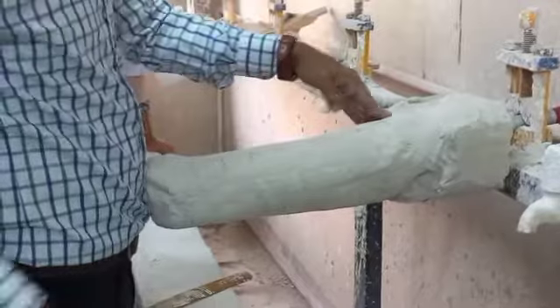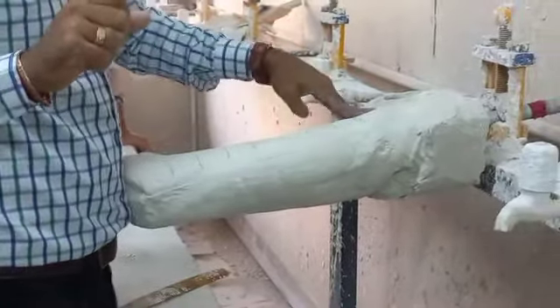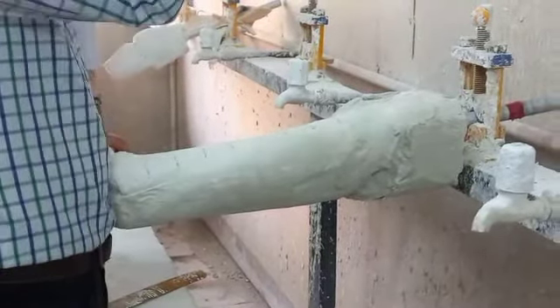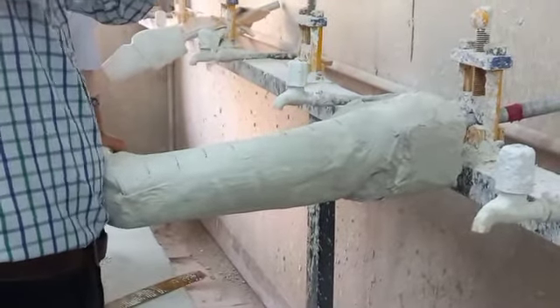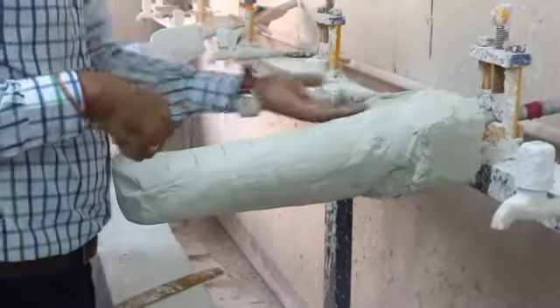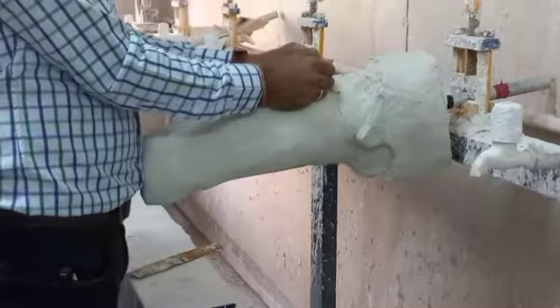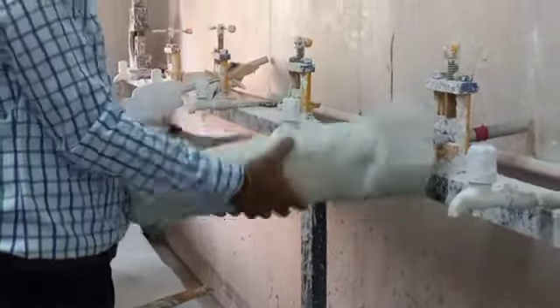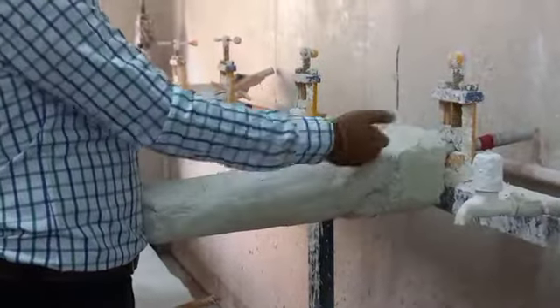You can easily reduce this area because, posterior and between the ischial ramus, this area is very much a cavity area. That means between the pelvic bone and the trochanter there is no muscle, it is kind of a pocket condition. So therefore we can easily reduce in this area. And then it must be made continuing with the measurement as I said regarding your reduction value. So you have to do the measurement just below the IT, the first measurement, and the percentage reduction comes to that measurement value.